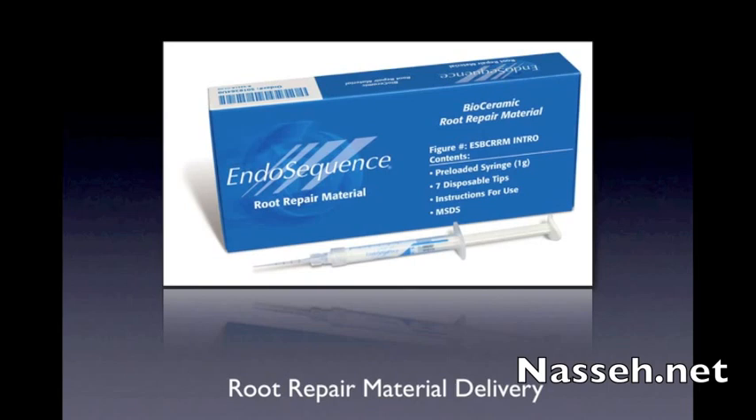Therefore, the delivery device is very important. Traditionally, we've discussed the use of the actual syringe and bending the tip 90 degrees in order to inject directly into the retro preparation.